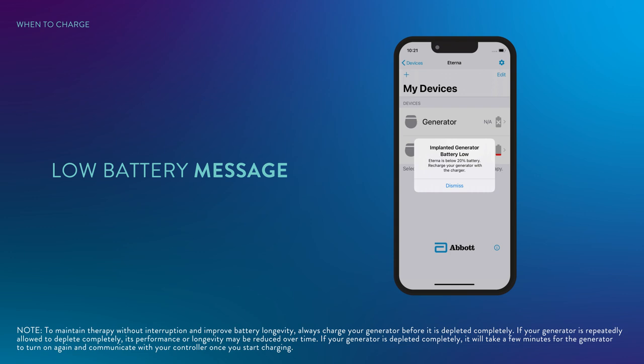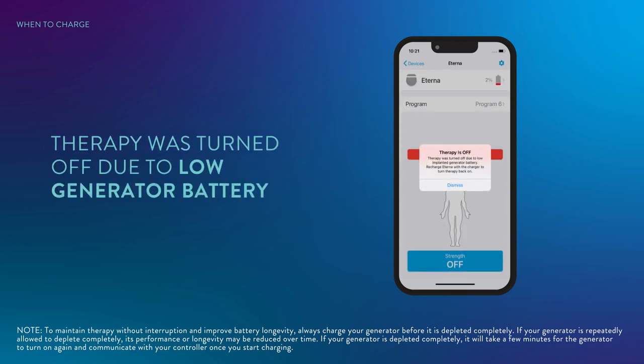If you do not charge your generator after the low battery message appears, your stimulation will eventually stop, and your controller will display an alert indicating therapy was turned off due to a low generator battery. You must charge your generator battery so that therapy can be restored.